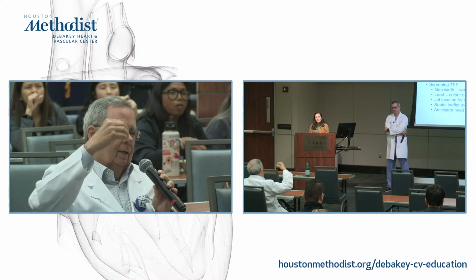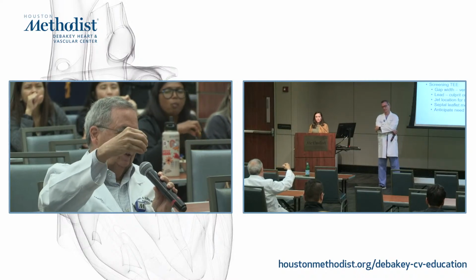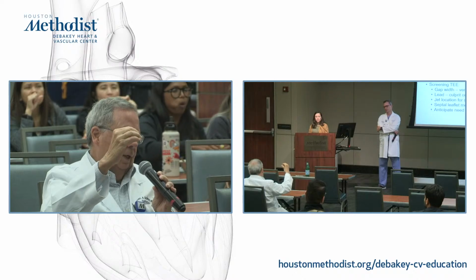Sorry, Dr. Q, as you have been learning with the tricuspid and doing more cases, are you lowering the bar for who gets the clip, i.e., severity of TR? Are you still doing the so-called torrentials, or are you also now moving more towards just plain severe? Number 2, symptom-wise.